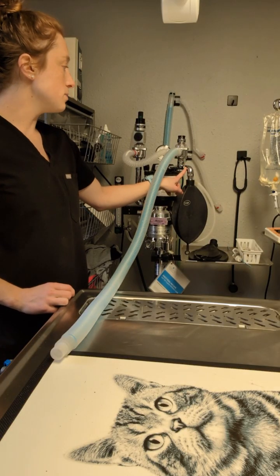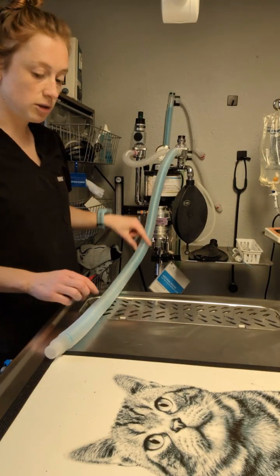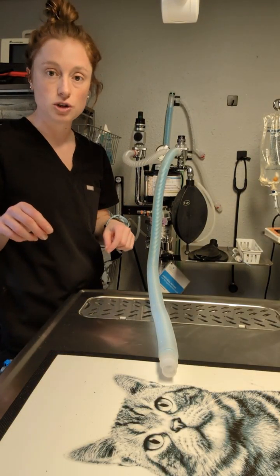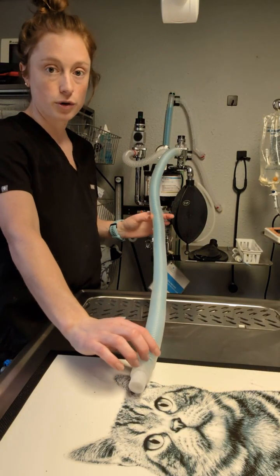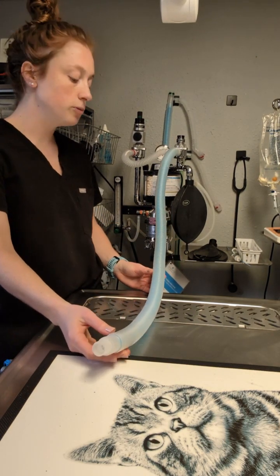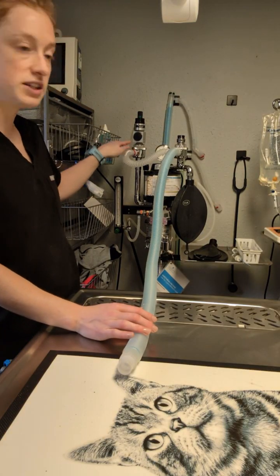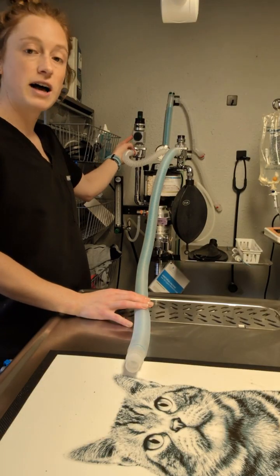So when the patient is breathing in, the gas will go into the inhalation valve, and then it will flow into the breathing tube and to the patient, to either the mouthpiece or the endotracheal tube. And then the patient will breathe out, and it will go back through the breathing tube. We have corrugated F circuit breathing tubes. When the patient breathes out, the air will go to the Y piece, and it will go into the exhalation valve this direction. And then the gas will exit through the adjustable pressure limiting valve, or the exhaust valve, up here.